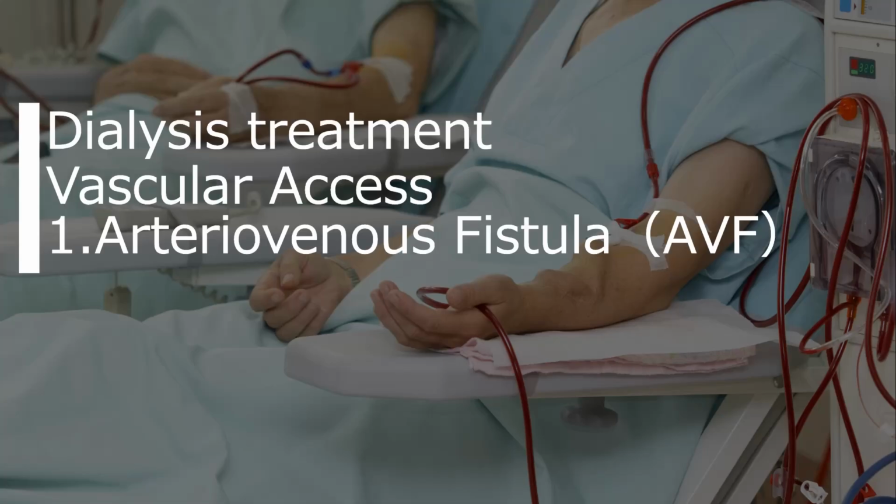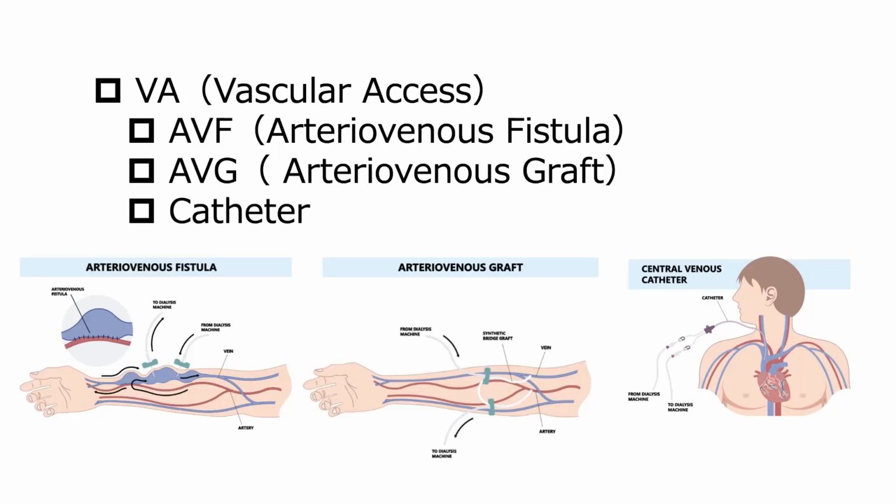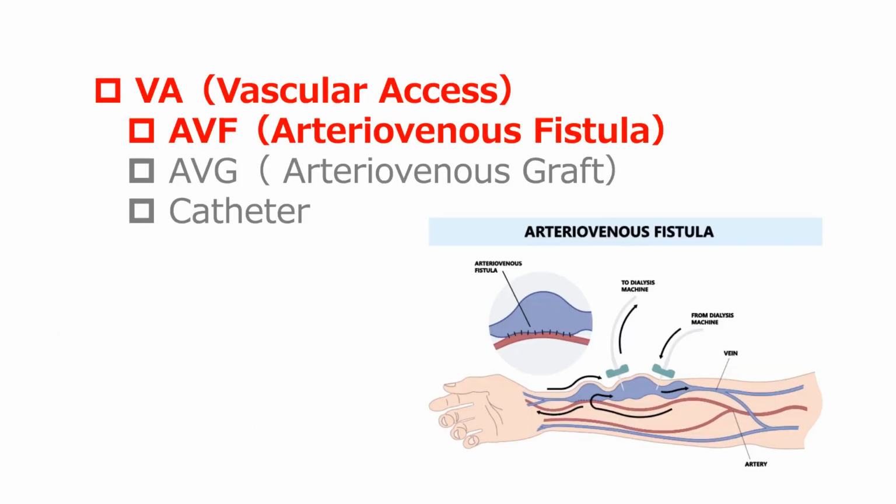This lecture will describe vascular access in dialysis treatment. Vascular access includes AVF, AVG, and catheter. This lecture will provide an overview of VA and AVF.